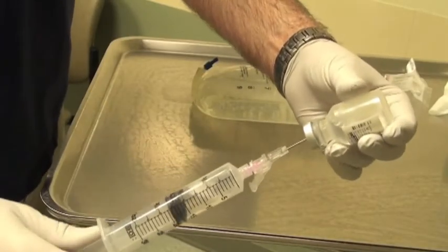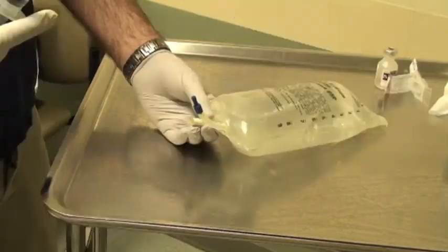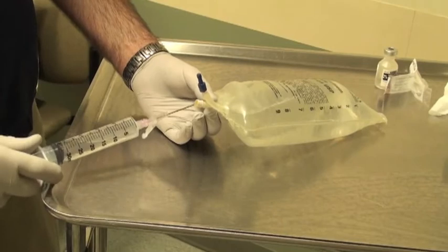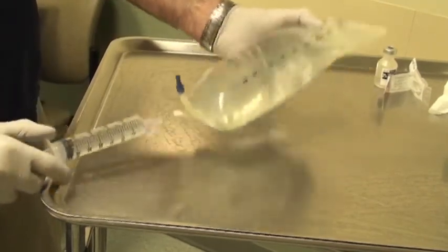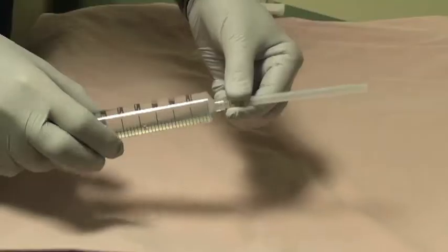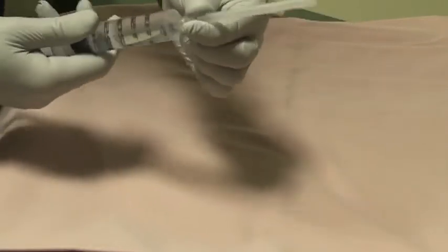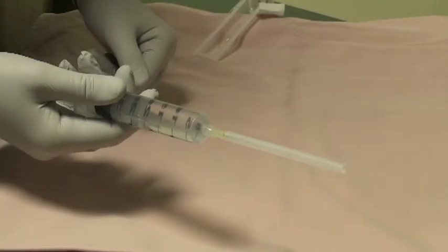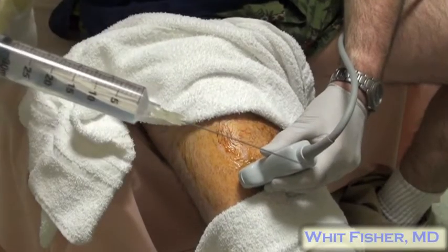So how can you use this to numb up a bad fracture like this one without narcotics? Well, in the cases I've treated, I've drawn up an appropriate amount of 1% lidocaine without epi, and then drawn up some additional saline into the syringe for more volume, and then I've attached a spinal needle to the syringe to give me enough length to reach the fracture site. Then I prep and drape the patient sterilely.